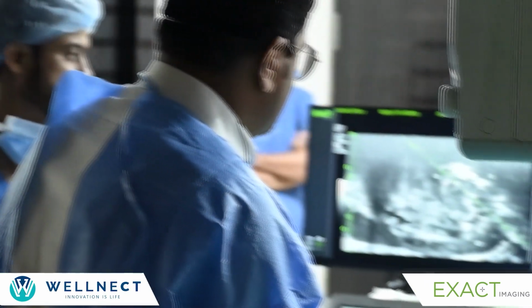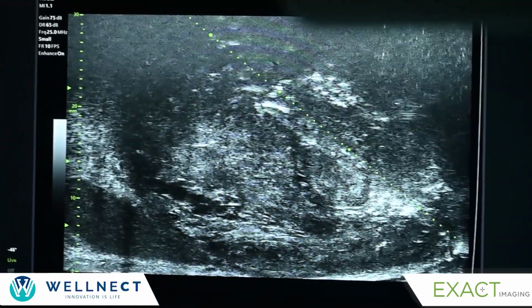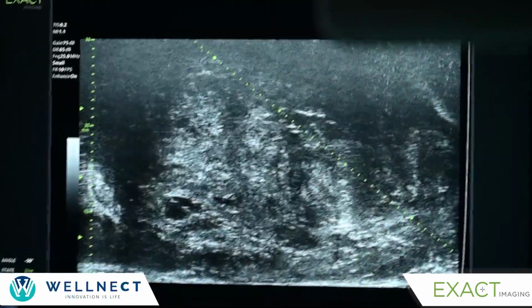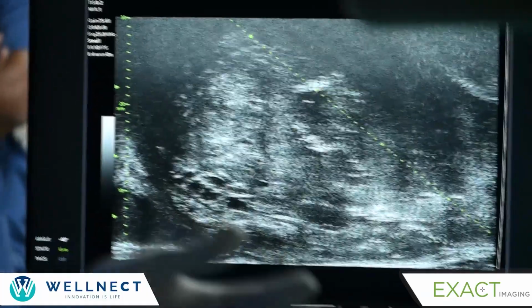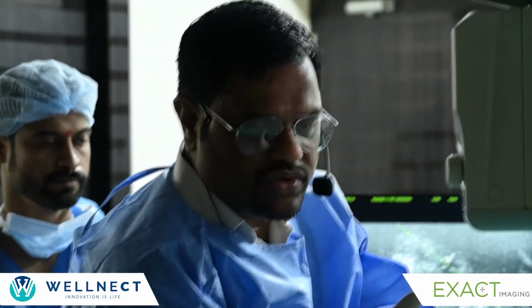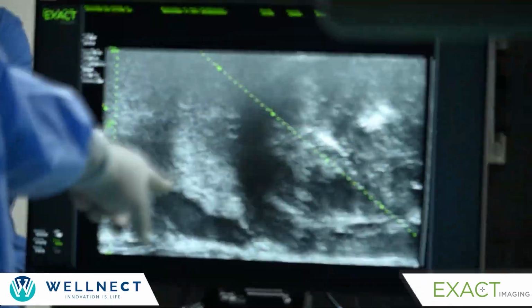The last biopsy that you take is again a targeted biopsy because I know this is a highly suspicious lesion. And can you see? It has gone through the lesion, half of the lesion is above and half of the lesion is below. Yes. So this core should definitely have the malignancy, and probably what over time will happen is that they will stop doing systematic biopsy, see the lesion, have a complete 100% core positive of the lesion. So two things you achieve. You prove that the patient has cancer. By local anatomy, probably I understood that there is no extra prostatic extension.